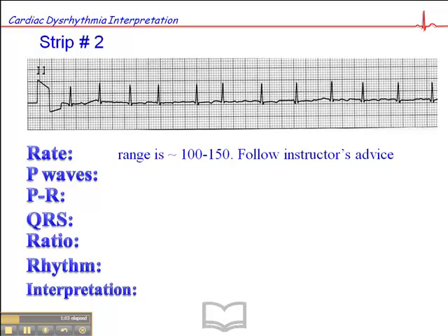We don't want to take a heart rate based on the two closest R-waves and the two R-waves that are furthest apart. We want to get something that's in the average range, and in my estimation it's somewhere between 100 and 150.